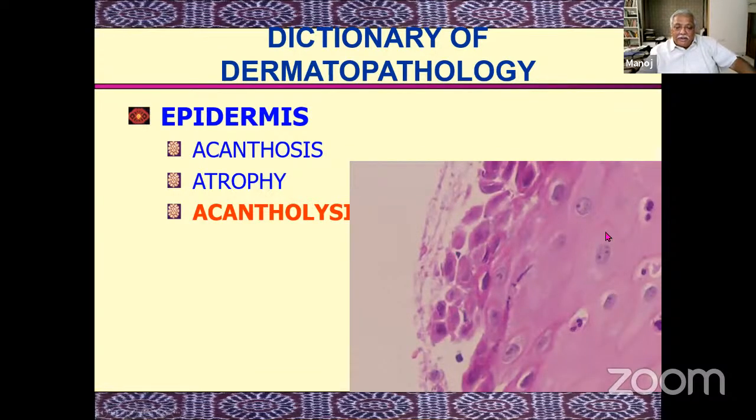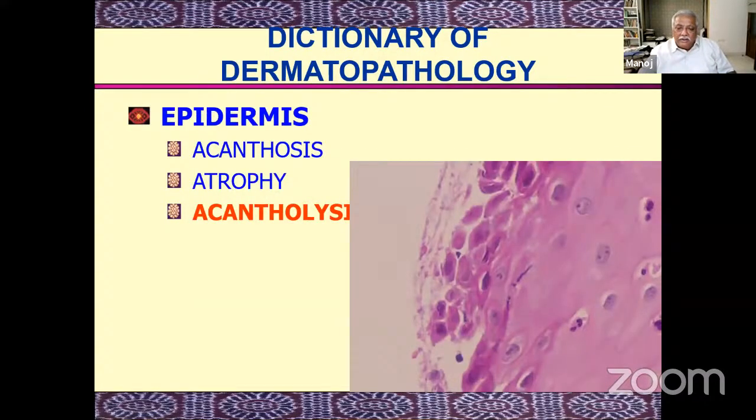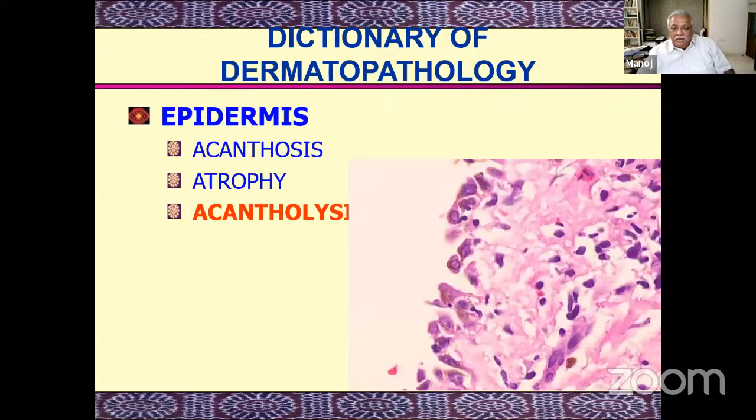The cells are separating. Now you see here, these are normal looking cells, and here the cells are separating from each other because they have lost their connection with each other. So these cells are much bigger, polygonal, pulled out. These have become much smaller, because they have lost the pull of adjoining cells.